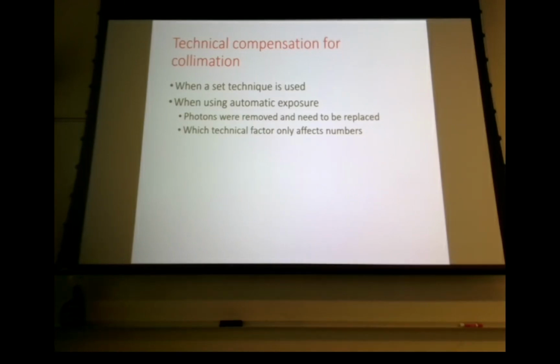according to the textbook. Now, you go into clinicals and you push the button for an asthenic patient for a KUB, and what you might see is 75 kVp, right? You push the button for a hypersthenic patient, what might you see? 80, 85 even. Okay, so is that a contradiction? It is, according to the literature.